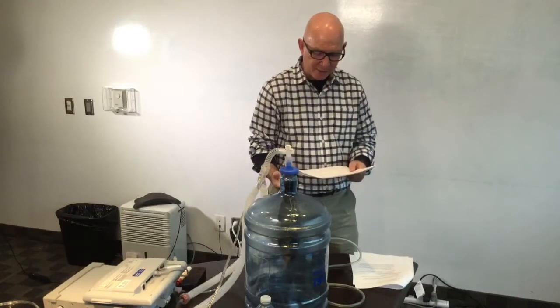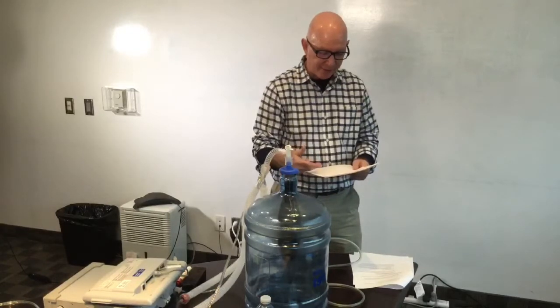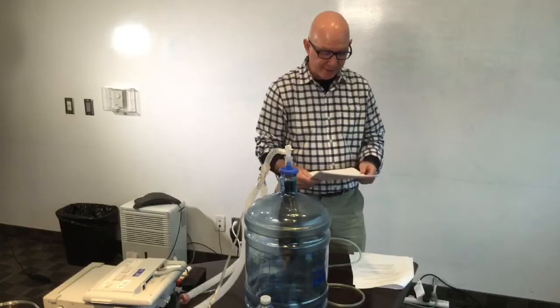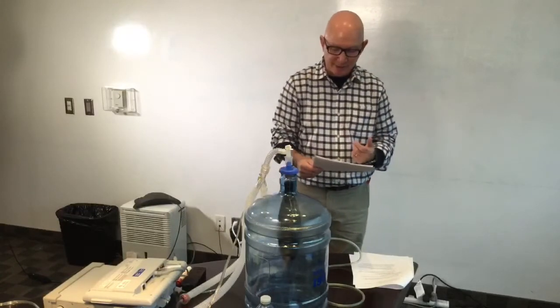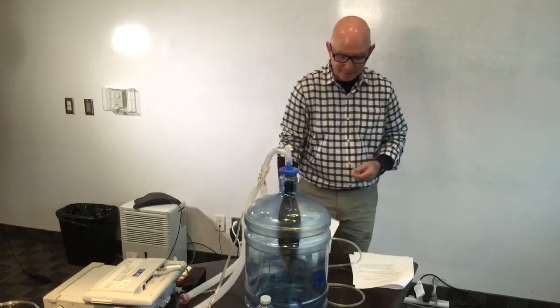They were difficult to ventilate due to the huge leak, and spent a long time with the staff at the sending facility adjusting flows, volumes, and head position to achieve a consistent exhale volume. Other than having the trach switched for an appropriate size, which wasn't an option in this particular case given what it took to get to where they are now, what suggestions would you say to optimize this child's ventilation?